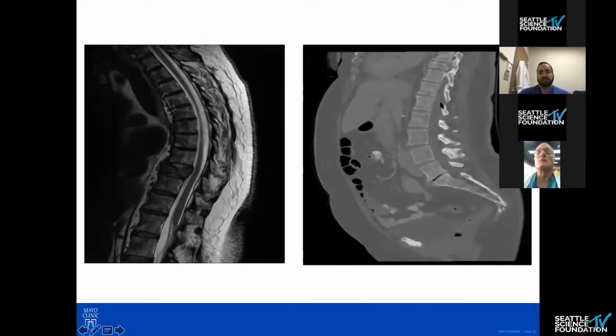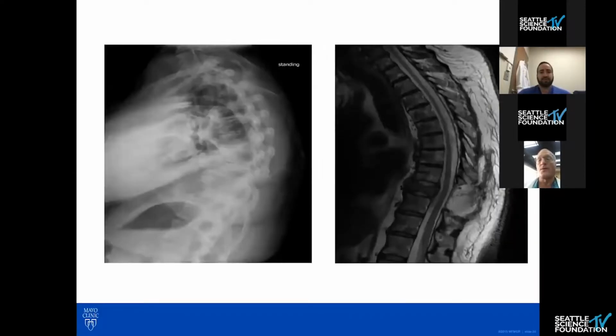Interestingly, she did not have significant compression, even though her SINS score was on the high side of the gray area. I think it was about 12 or 13. So she underwent a separation operation with fixation. You can see just barely the outline of the instrumentation. We were playing with the different rod contours. And you can imagine that unlike titanium, you cannot bend these rods, so you have to deal with the different rod contours.